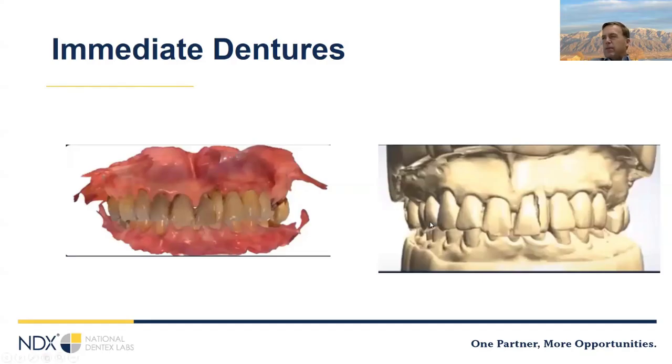The other thing to keep in mind about these is that normally we do what I call lab extraction, which is we just basically digitally cut the teeth off at the gum line. If you do want some alveoplasty, let your lab know. In general, my experience is it's better to let us do what we do and then plan on putting some Lynol in there after the extractions.